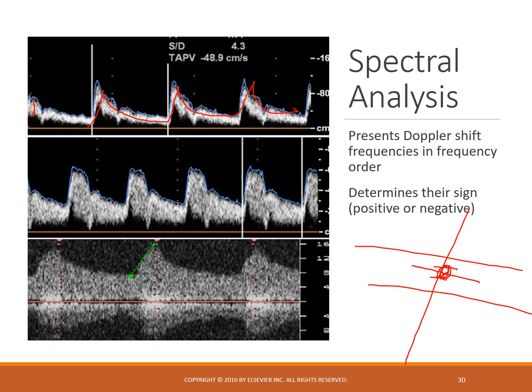The next moment, more blood comes through and it draws a line from the maximum to the minimum. So here you see the velocities in this sample are from about 80 to 40. At this moment in time, passing through this sample, I had a range of velocities from 40 to 80.